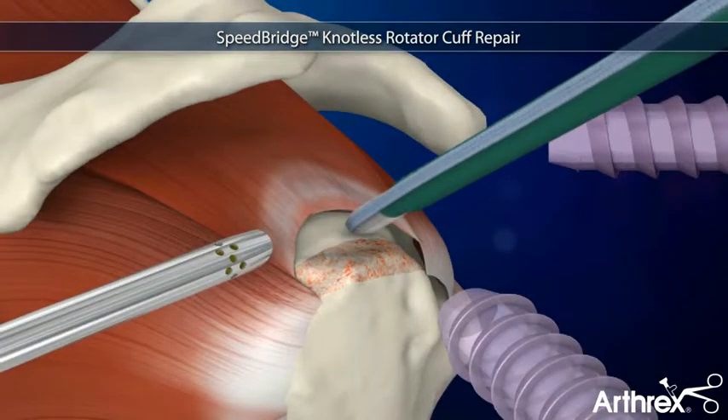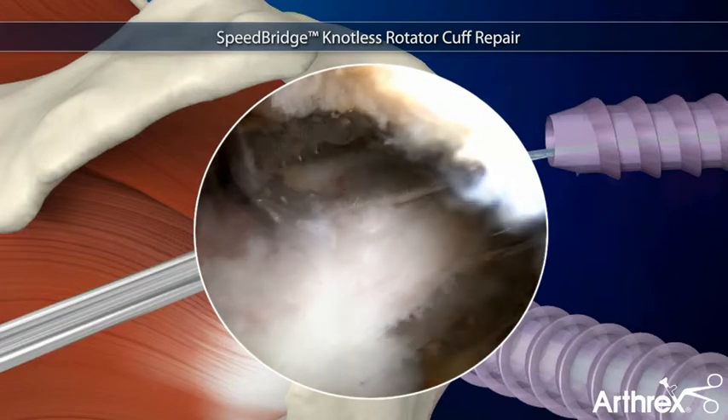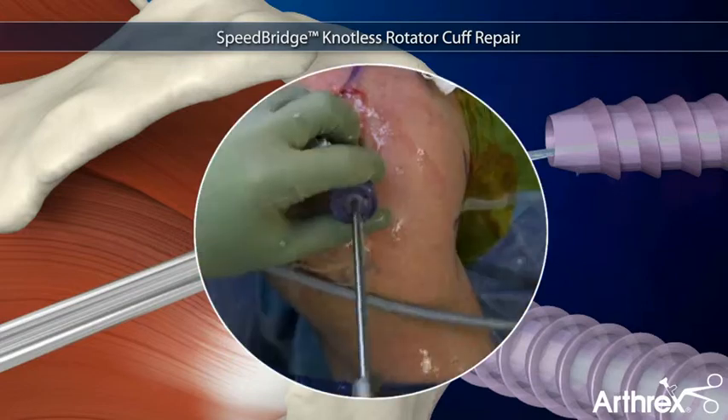To perform a Speed Bridge, a swivel lock pre-loaded with fiber tape is inserted at the articular margin. The fiber tape tails are joined together to allow easy passage through the tendon with a fast-pass Scorpio.